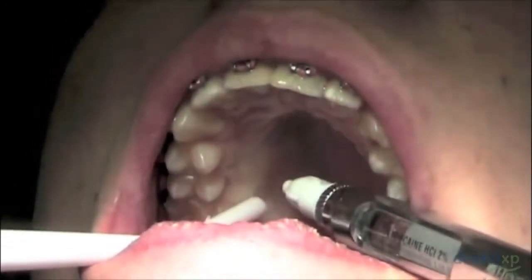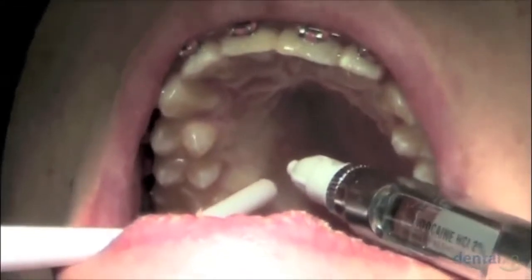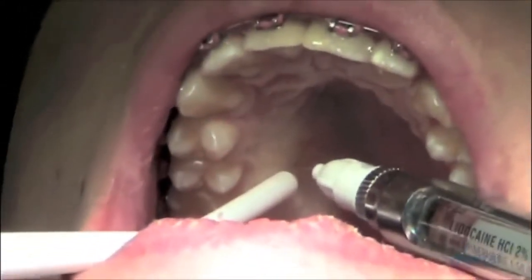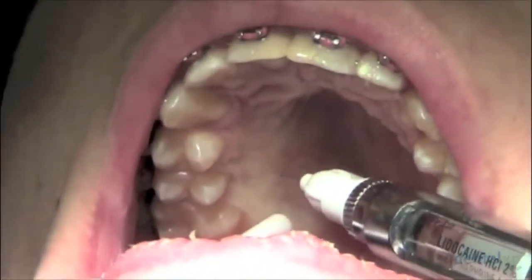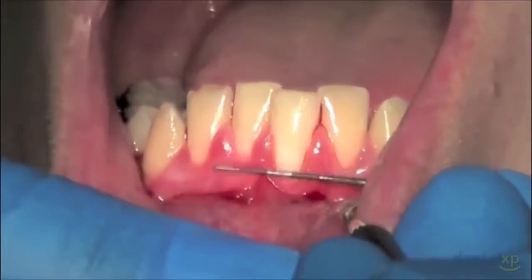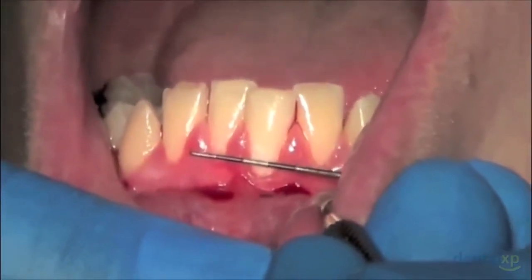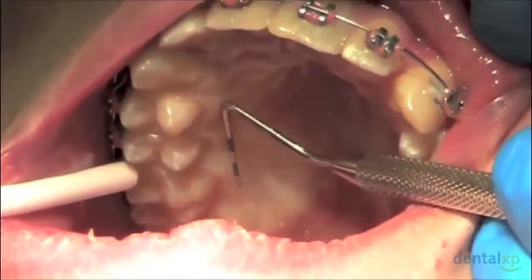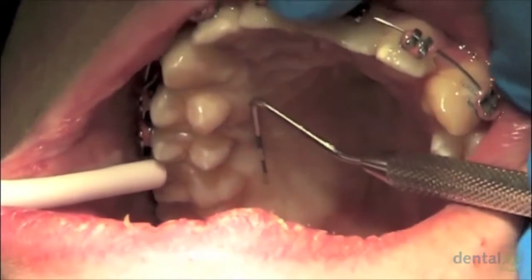In this situation, this gentleman, who is a 14-year-old healthy male, is going through orthodontic treatment for the upper arch, and as they're getting ready to put brackets on the lower arch, his orthodontist has requested that the tissue be augmented in the area in order to prevent any possible future recession as the teeth are being corrected for crowding.